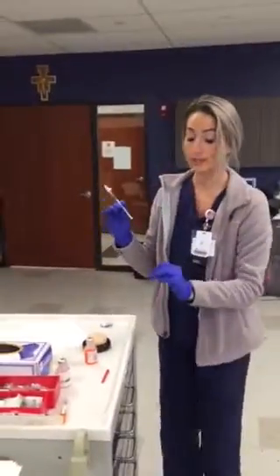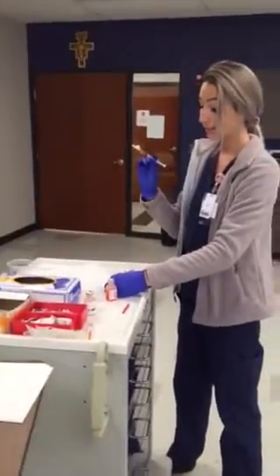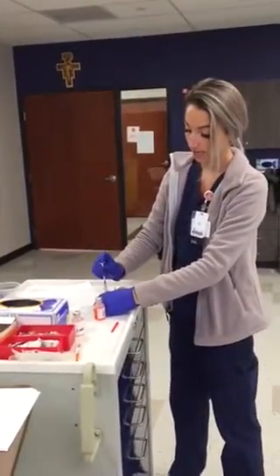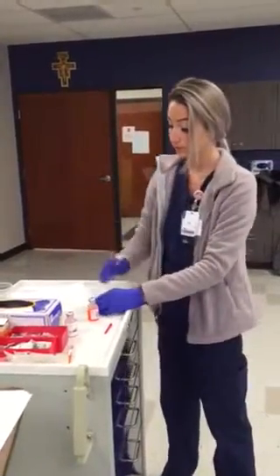For her I'm going to put it in. I'm gonna kind of widen and then I'm gonna put it in like a dart. So I'm gonna inject it straight in, and I've wiped this with an alcohol swab and inject it back completely. So the needle goes straight in.